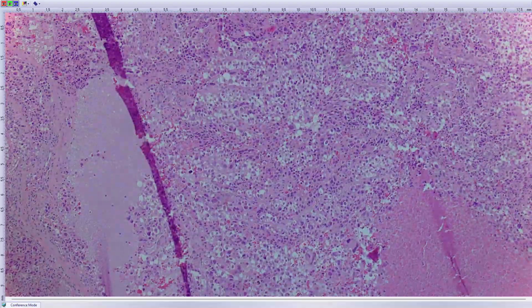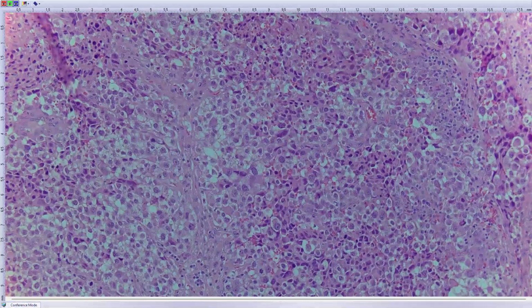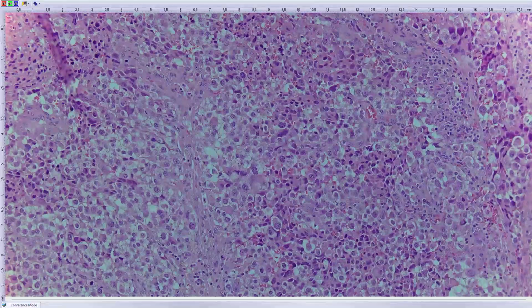I was looking for the slide for another reason, because we have this patient in a study, but I wanted to know what this lesion was actually. So I got these slides. This case was diagnosed as undifferentiated pleomorphic sarcoma at that time, because it really is an undifferentiated, ugly-looking tumor, which was basically immunohistochemically negative for everything. Everything was negative here.